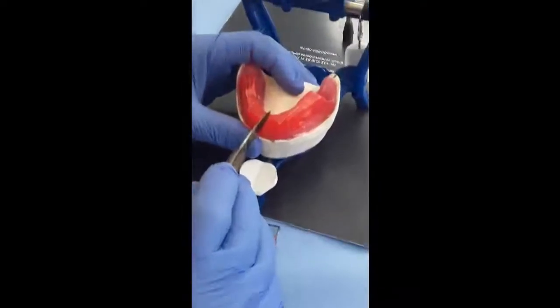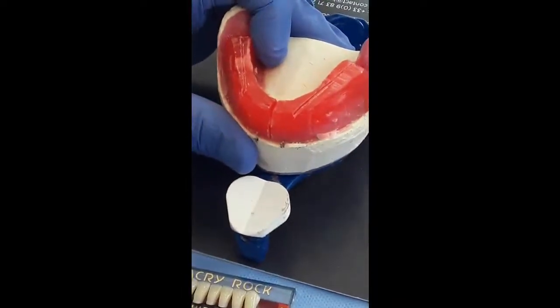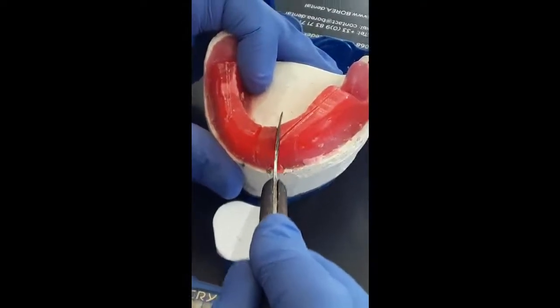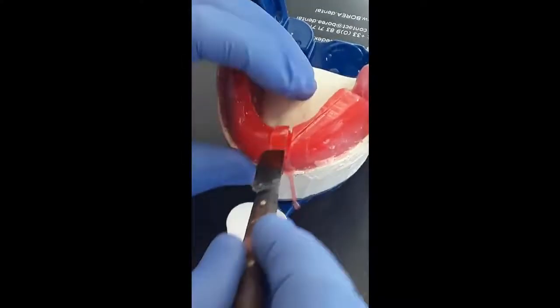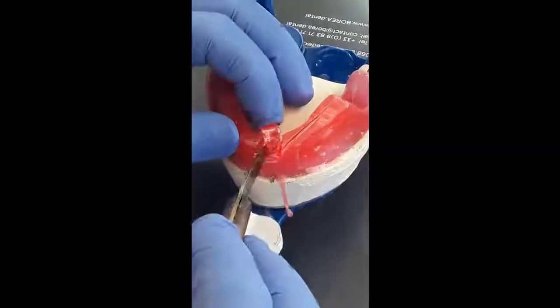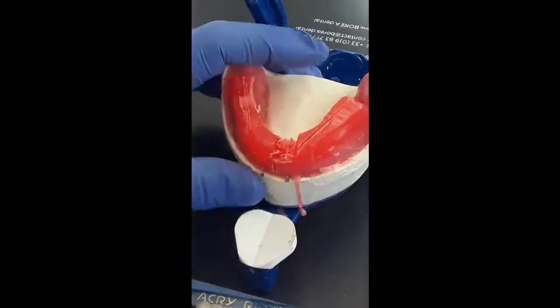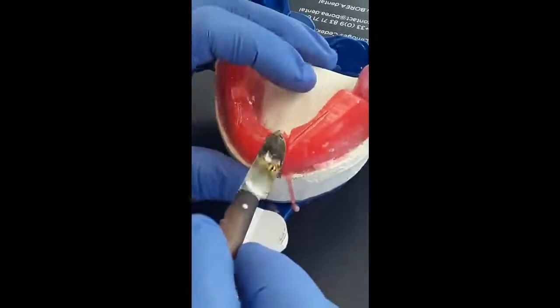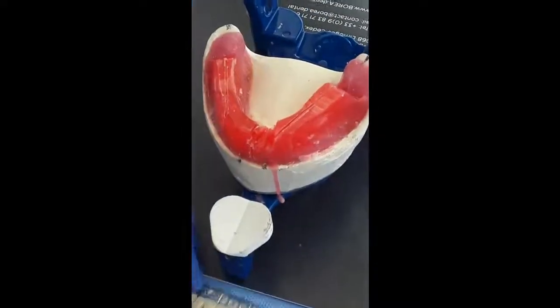At the midline, as you can notice here, we'll remove a piece of wax from the buccal to the lingual, and we soften the wax in the area so we can insert the tooth.